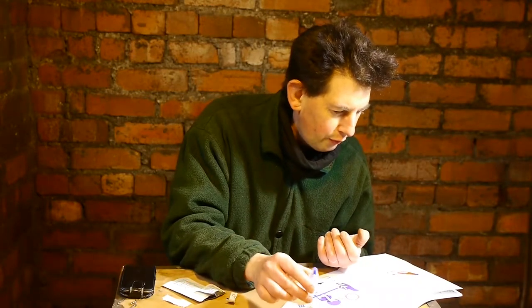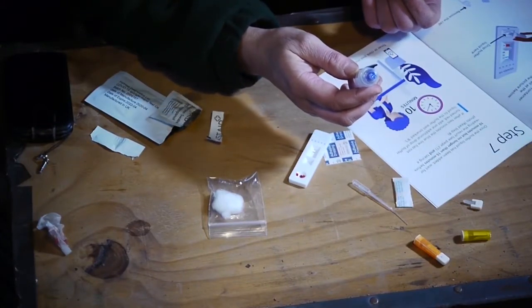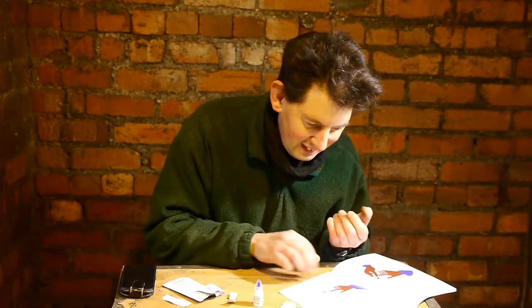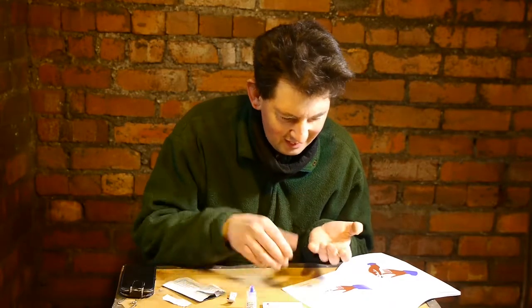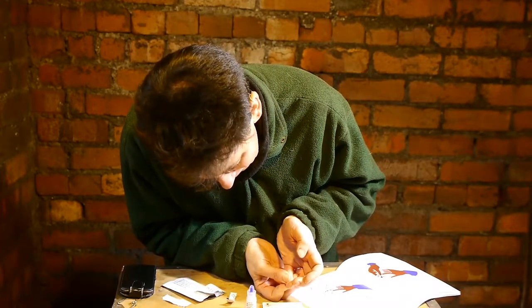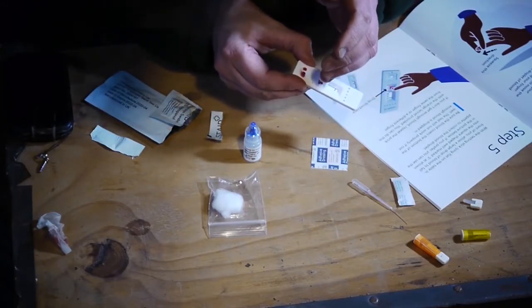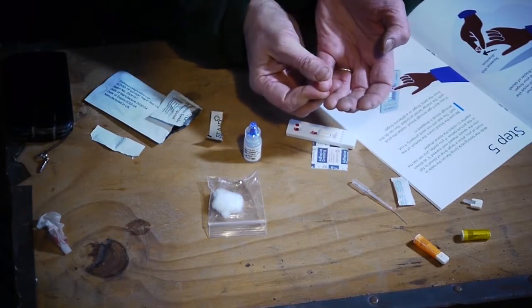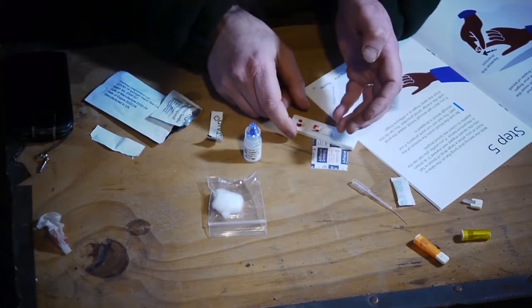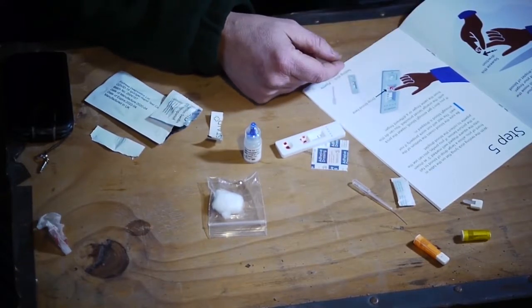Okay, remove the cap from the buffer liquid. Add 2 drops to the circular well. Ah, no, I've put the sample in the wrong place. Oh no, that was a mistake. This probably isn't going to work now because I put the blood in the wrong place, but you never know, it might do. What a disaster. Okay. There we go. What a disaster. Put the blood in the wrong place.